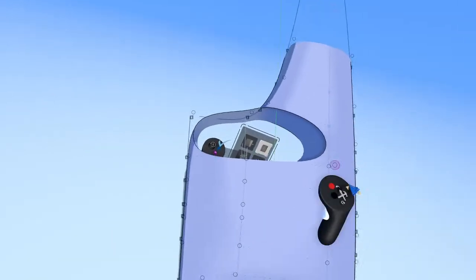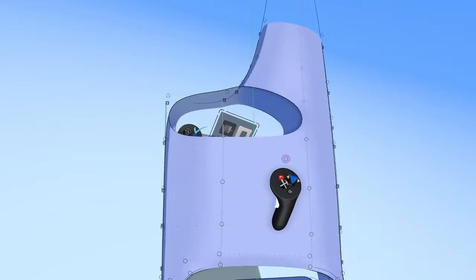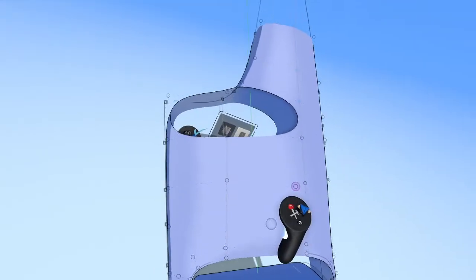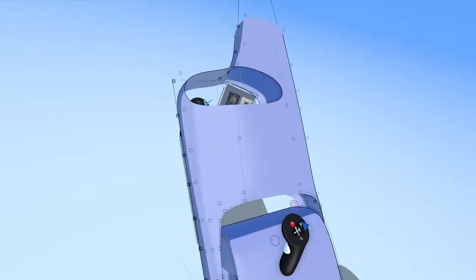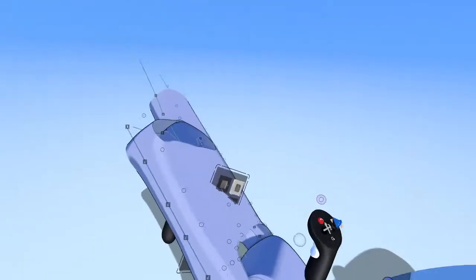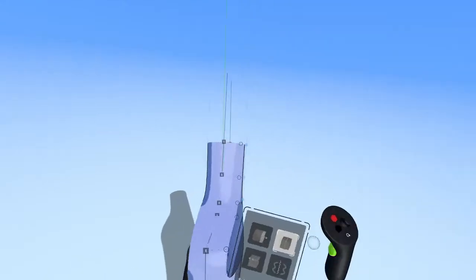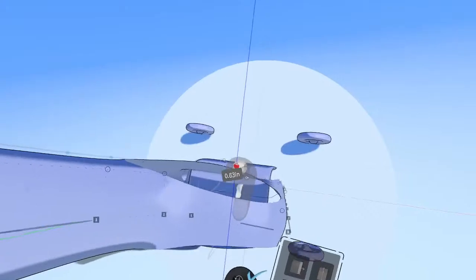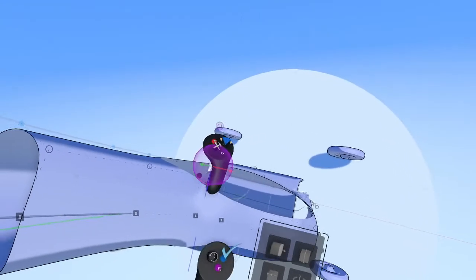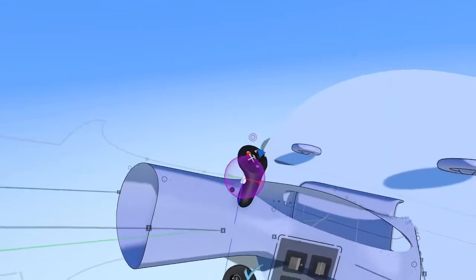You'll notice a lot of what I'm doing is trying to simplify the amount of geometry that I have here. Again, complexity, if it's not needed, you want to keep it as simple as possible. And so sometimes I'll just turn on auto edge loops and delete an entire row of edge loops.